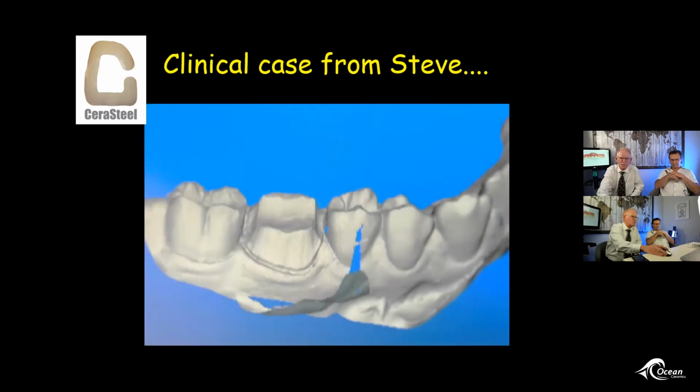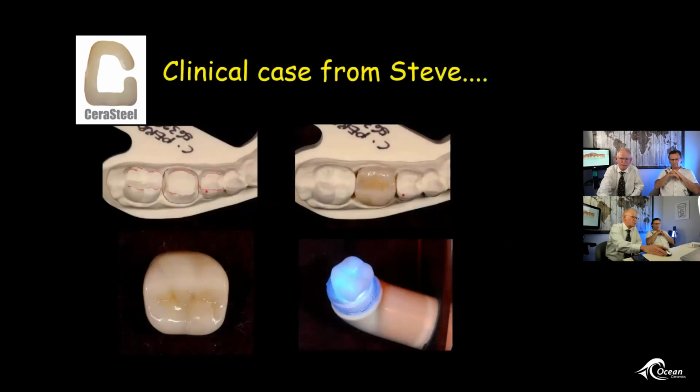There's my final preparation. That's tooth number 4.6. Nice retraction. Got the cusps being able to be put in the right place. Too many times, if you don't do this, you get this huge expansion of the occlusal table in order to put the cusp out a little bit further, but then they have to be a lot shorter.